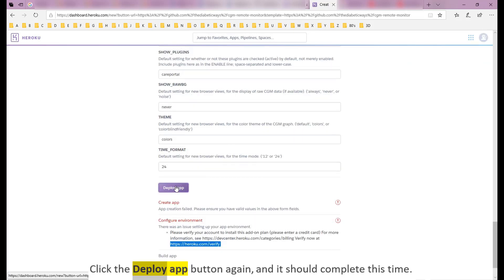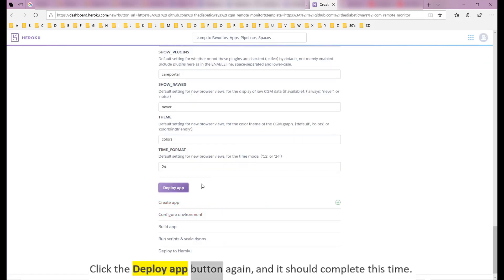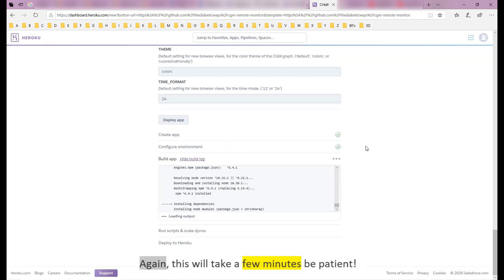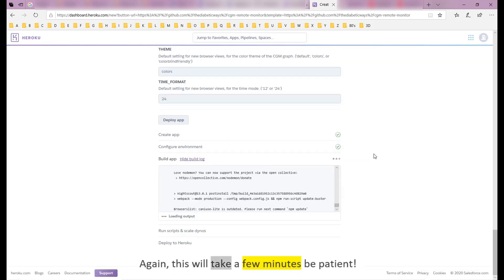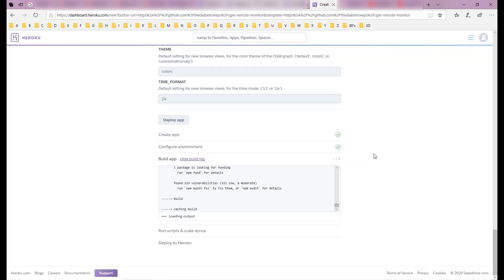Click the Deploy App button again, and it should complete this time. Again, this will take a few minutes, be patient.